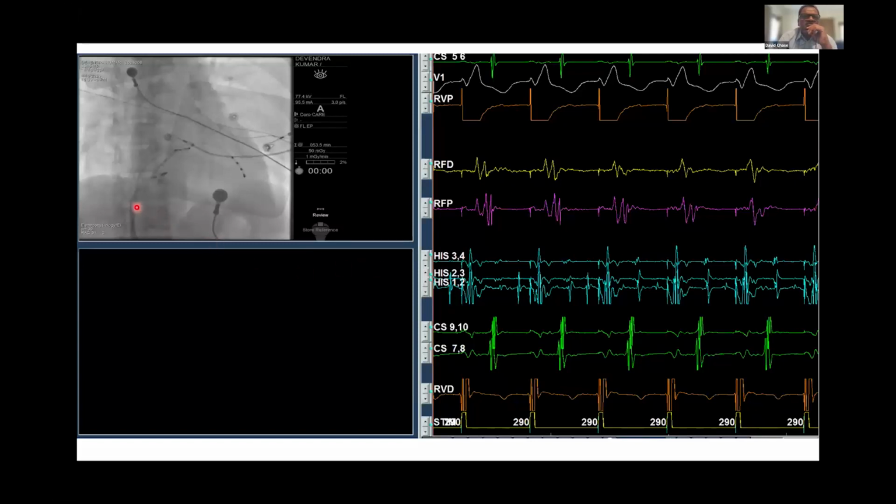In this instance, this is the catheter which is able to identify that there is a ventricular EGM and an atrial EGM, and they're almost so close to each other that you cannot separate between them. You have to stop pacing and see whether there is a separate atrial event and a separate ventricular event at that time, then reconfirm. But that tells us that this is the location where atrial pre-excitation is happening as a result of ventricular pacing. So both are the methods used.